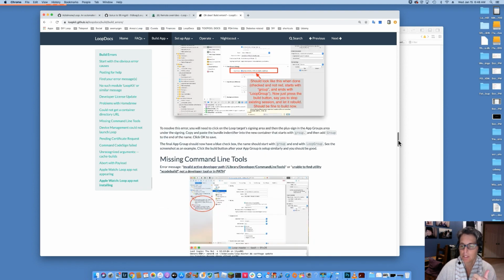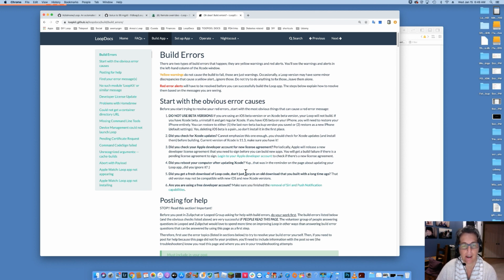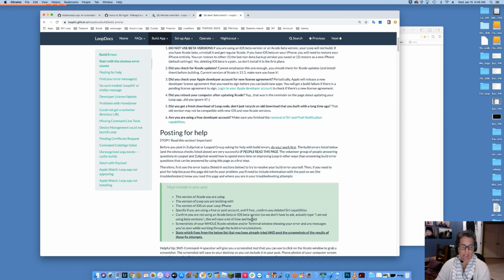So clean your build folder, check your command line tools, check that Xcode is all up to date, check that you have your developer license agreement up to date. They issue new ones about once a year. Rebooting your computer isn't a bad idea at all, especially if you just updated Xcode. Make sure you're getting fresh downloads of Loop code. Don't recycle the ones that have been sitting in your account for a while. So all of those things are really good.